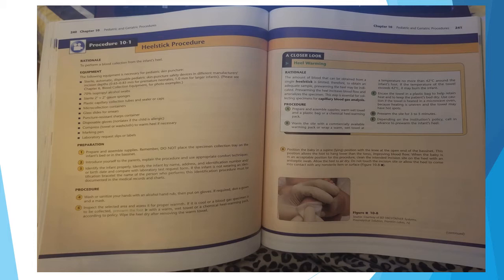Procedure: wash or sanitize your hands with an alcohol hand rub, then put on gloves if required, don a gown, and a mask. Inspect the selected area and assess it for proper warmth. If it is cool or a blood gas specimen is to be collected, pre-warm the foot with a warm wet towel or a chemical heel warming pack according to policy. Wipe the heel dry after removing the warm towel.